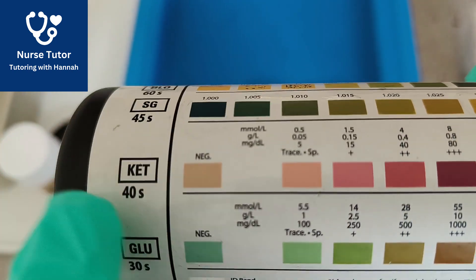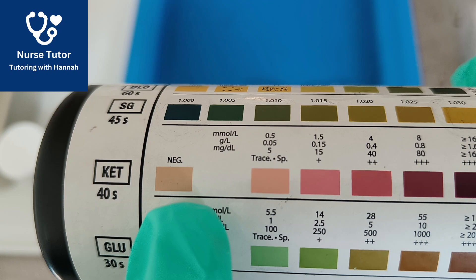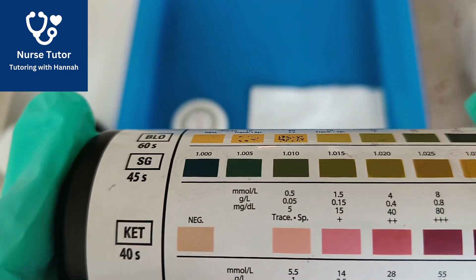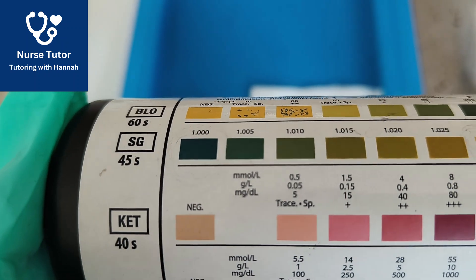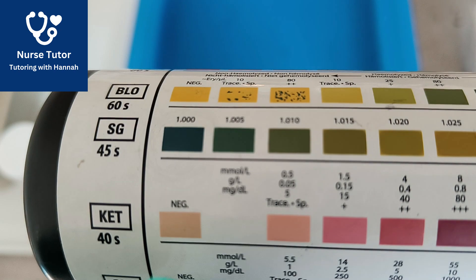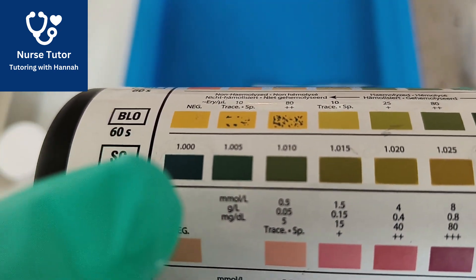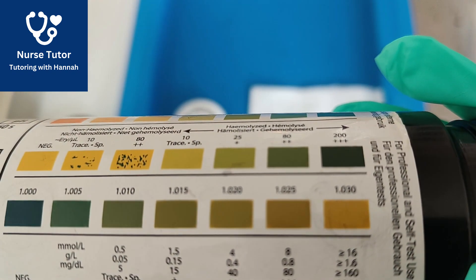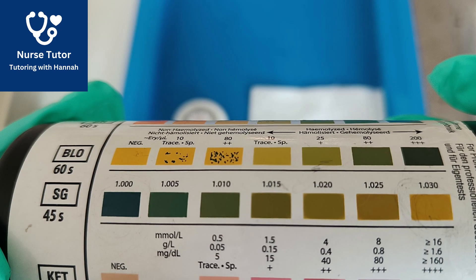We then need to wait 40 seconds to read ketones. Negative will stay a light pink colour, and the darker purple it gets, the more ketones are present. Once 45 seconds has passed, we're going to read the specific gravity — the concentration and osmolarity of the urine. Very dilute urine reads around 1.000 at the lower end, and as it goes up it's more concentrated urine towards the orange and brown.